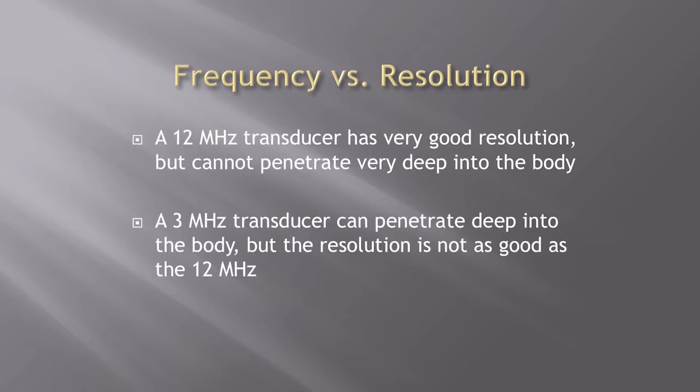So, we'll talk about this already. 12 megahertz, higher number, faster, better image. Low megahertz, smaller number, goes very far, not the best image.